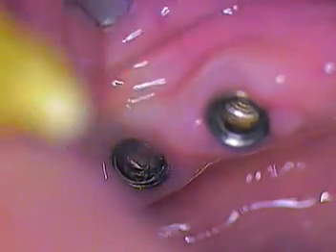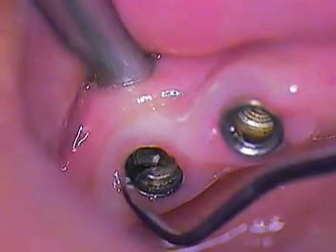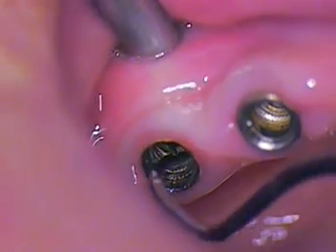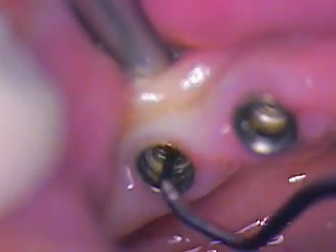Chin down just a little. So there's the plastic. Now we're going to start to back it up slowly. Hopefully it'll come straight up to us. We're getting it to roll. At least we went 720 degrees, so we went around twice already.